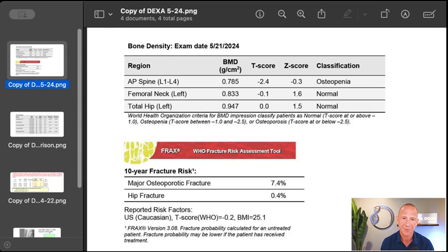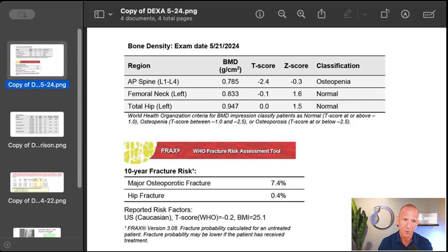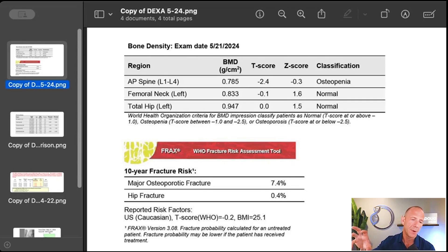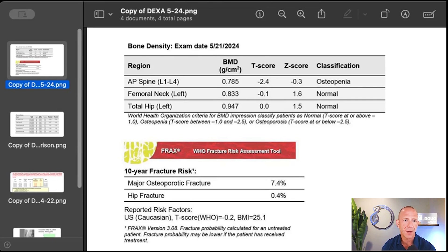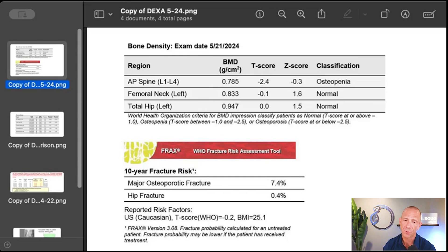This is an example of what you would get from your doctor after a DEXA scan. Please understand that all of these reports look differently, so it's important you know what to look for. The areas we're mostly interested in are spine and femoral neck — you want something around the hip, femoral neck or total hip, and then the spine L1 through L4. You can see the date, the AP spine L1–L4, femoral neck, and total hip. Often they'll only report on the left side.